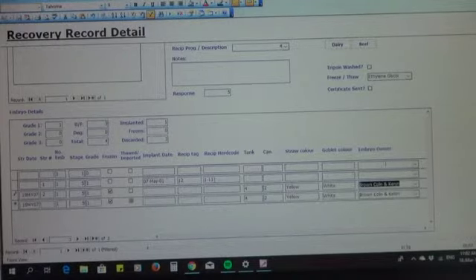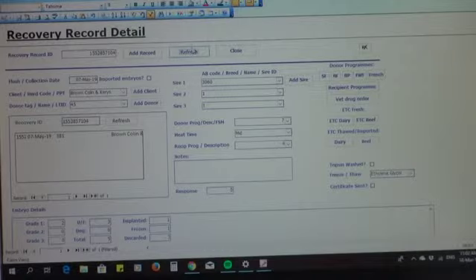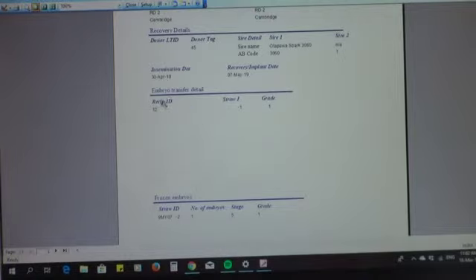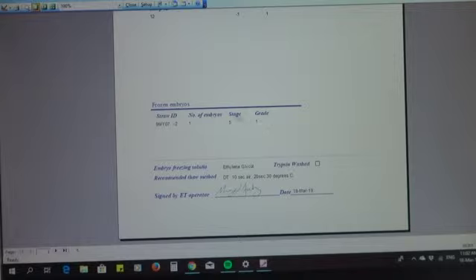This is not usually important, but sometimes it is because Colin might sell those embryos. So now if we refresh and look at our embryo transfer certificate, it says we implanted 1 and we froze 1 here. So Colin and the Angus Association will know what there was.